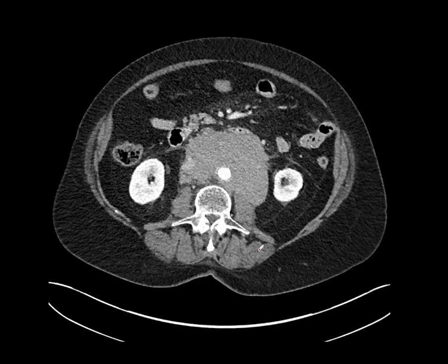Now I just want to say one quick word about the sampling of these lesions. I mentioned that it's very important to try and see the whole of the lesion in order to adequately assess it. Now, many of the previous guidelines have said that in lesions greater than 10 centimeters, you should perform MRI in order to fully evaluate the cyst. But I think in recent years, and I've certainly seen this at recent RSNA meetings, the emphasis is rather on you making up your own mind about that.